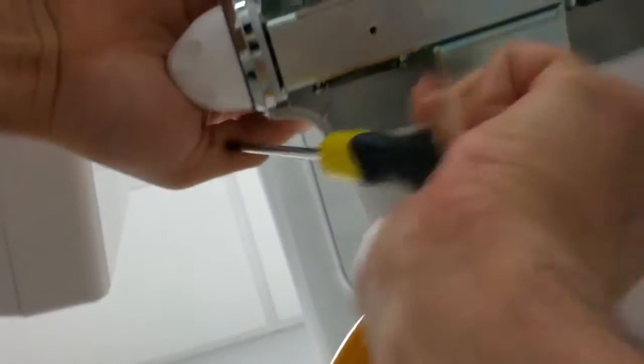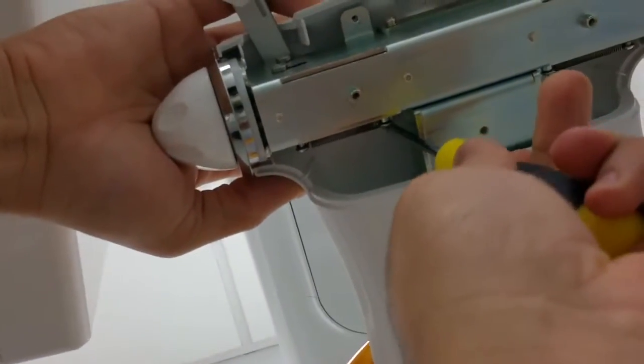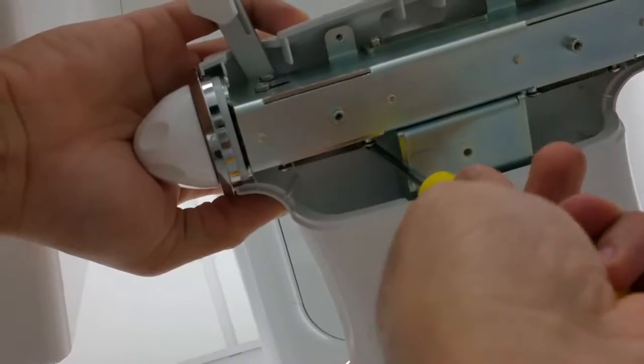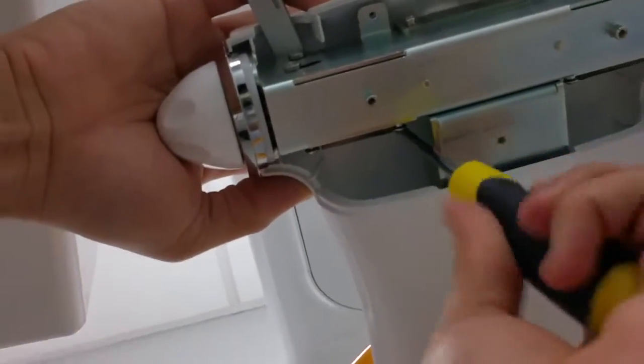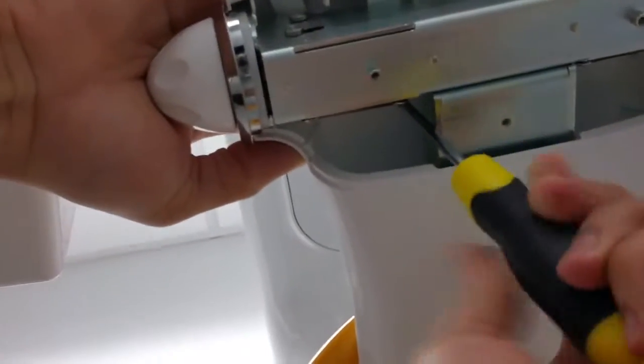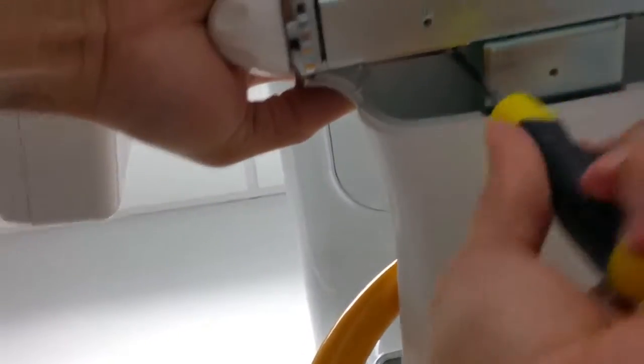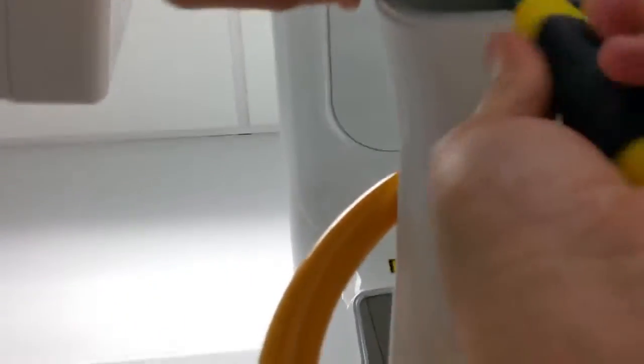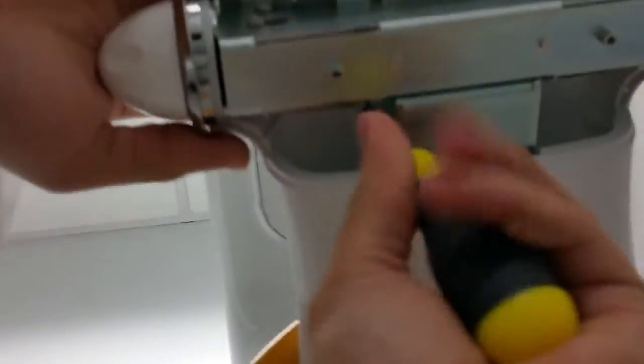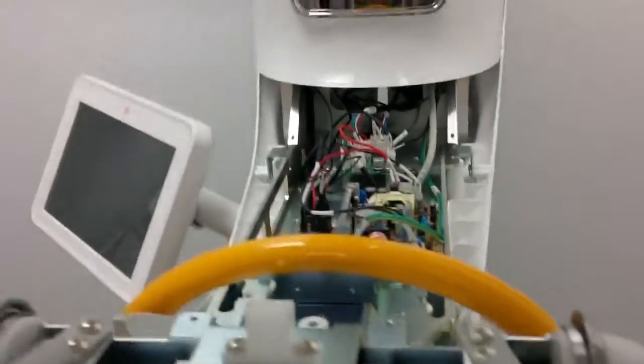Here we go. So we take the top piece completely off, giving us access to the last three screws.